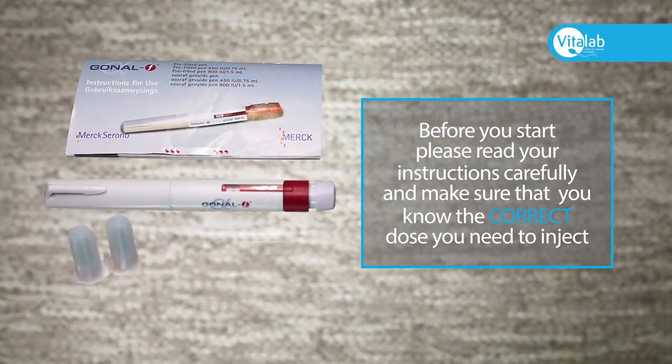Before you start, please read your instructions carefully and make sure that you know the correct dose that you need to inject.